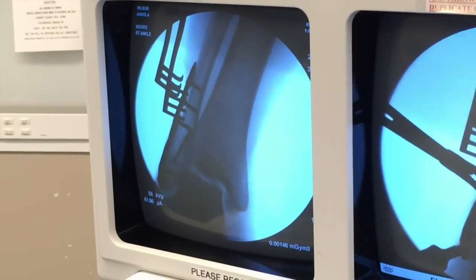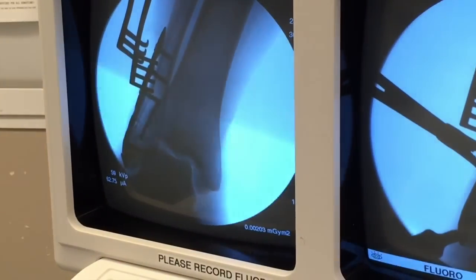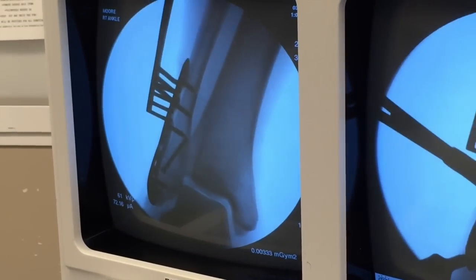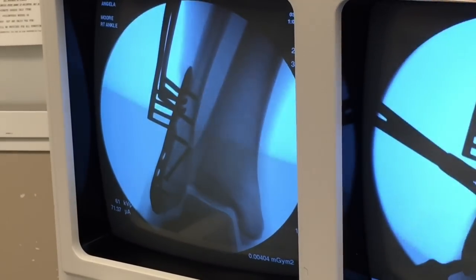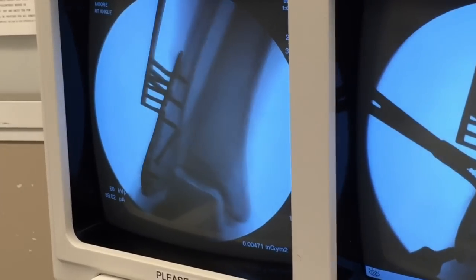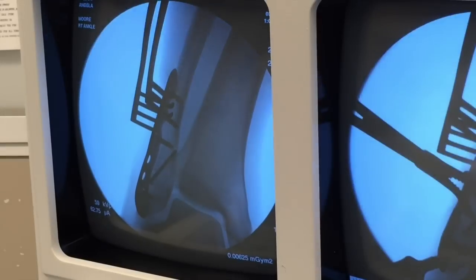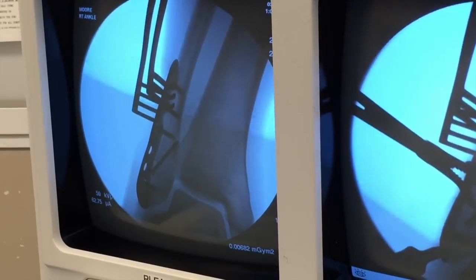All in a row — there we go. There's all the screws. The lag screw is in the middle there. Mission accomplished — the Stryker Variac Compression Plate System.